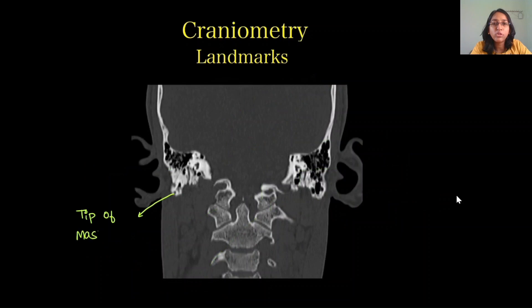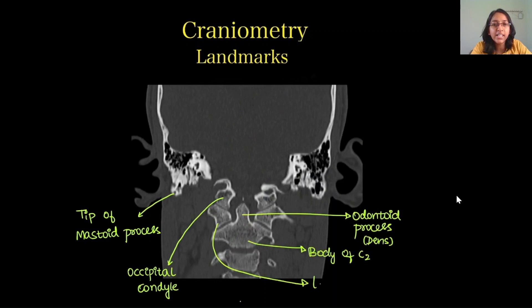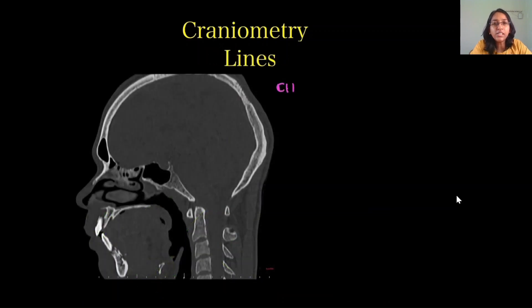On the coronal sections, we can see the tip of the mastoid process, the occipital condyle, the odontoid process or the dens, and the body of C2. The lateral masses of the atlas are visible bilaterally. These structures form the craniovertebral junction.